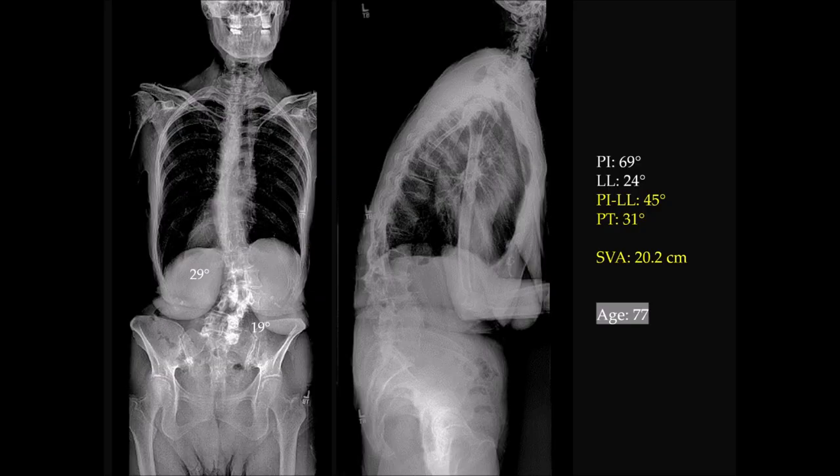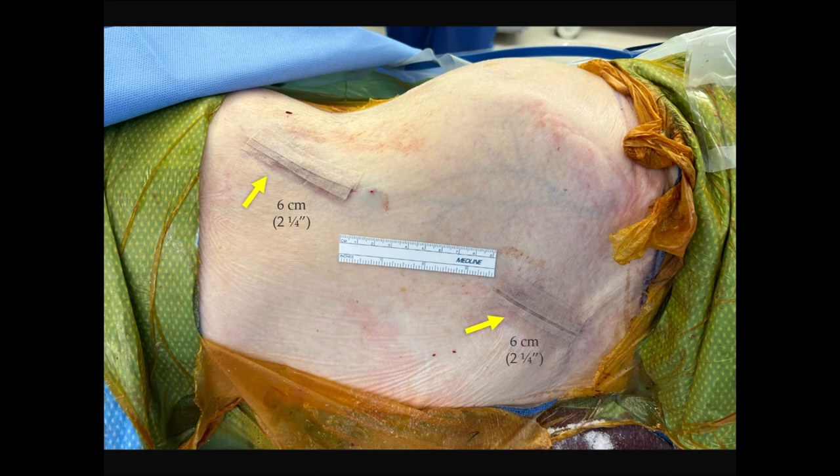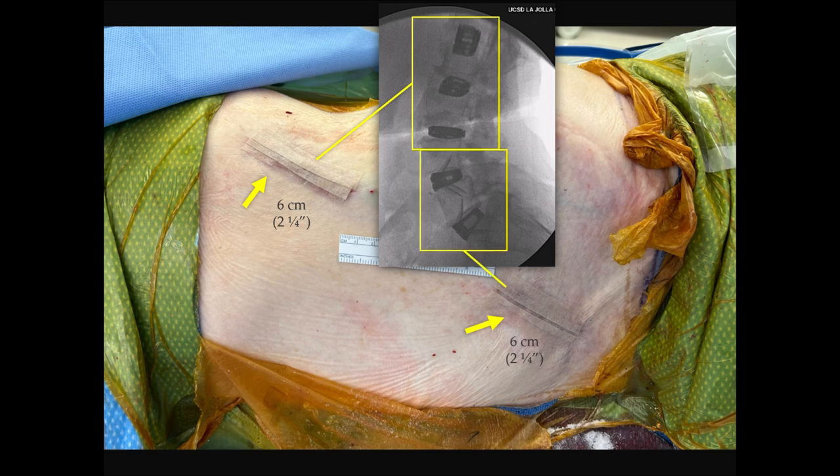In terms of cases — this is the lady I introduced earlier when discussing adult spinal deformity. She has a mismatch of 45 degrees, pelvic tilt of 31, and her age is 77. When you think of elderly folks with this kind of deformity, a purely lateral approach can restore sagittal balance. Those bottom two cages are lateral ALIF cages. Her incisions are two and a quarter inches up top and two and a quarter inches at the bottom, and through these small incisions we're able to place five interbody spacers.